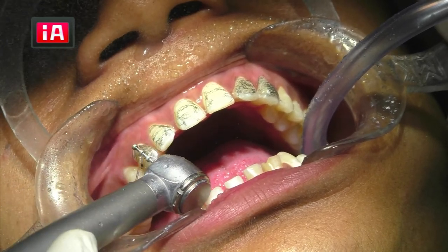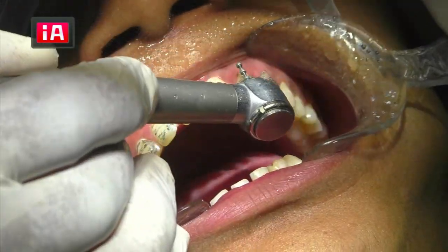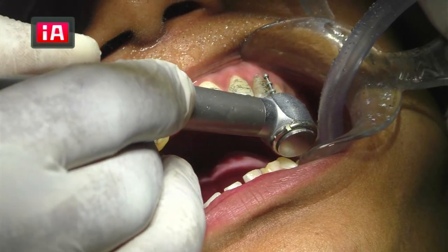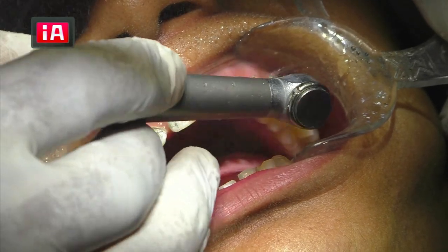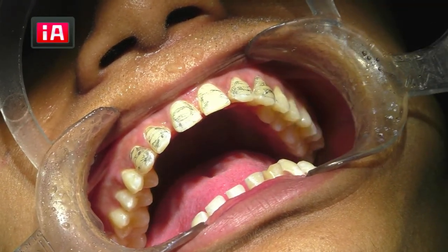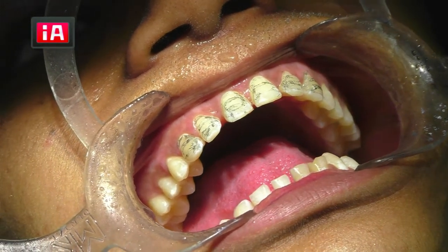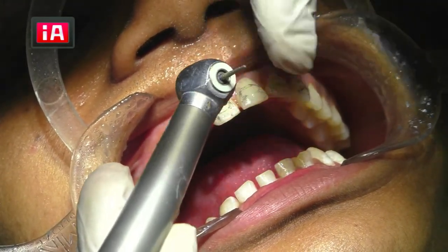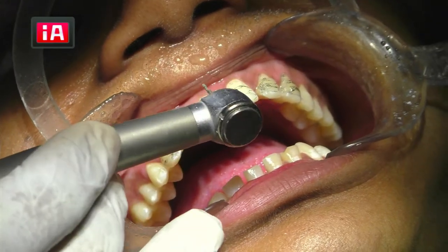I'm doing it everywhere. We have done the depth cutting grooves everywhere. Now I'm going to start reducing the tooth structure, starting from the central incisor onwards. You can see the burr now. This is a tapered fissure burr, a tapered burr which has a nice shoulder. I'll start using this.